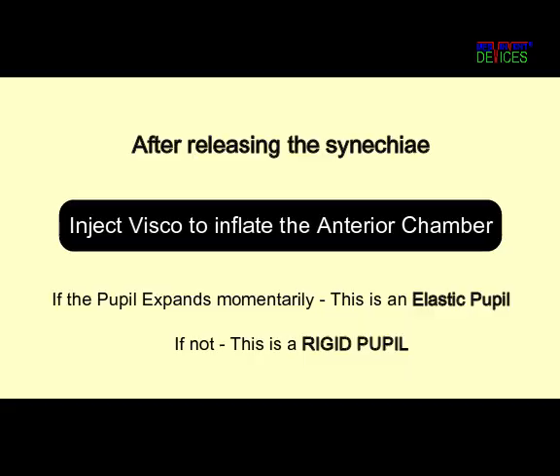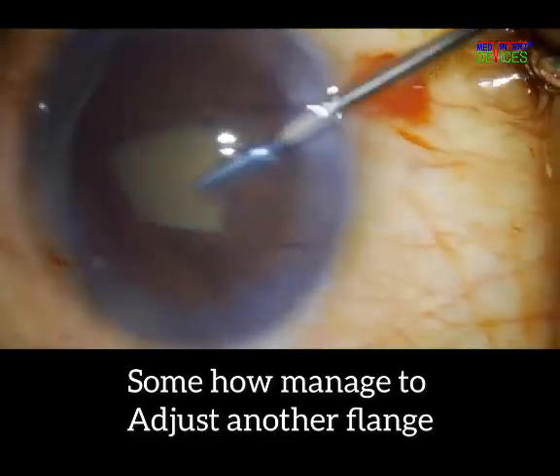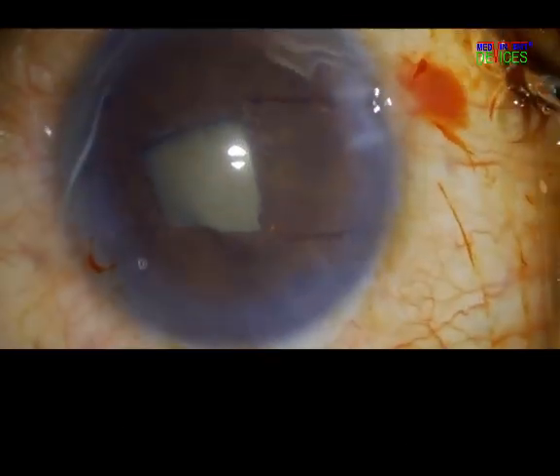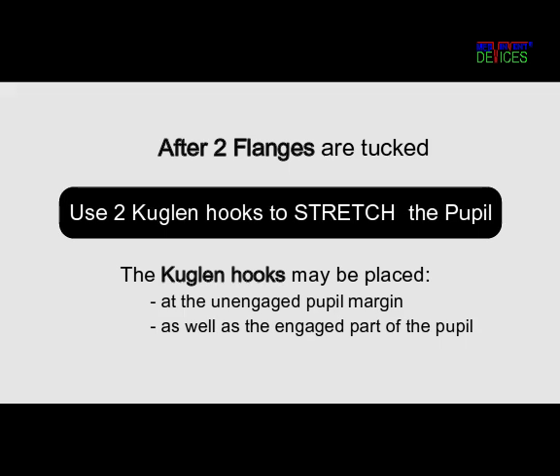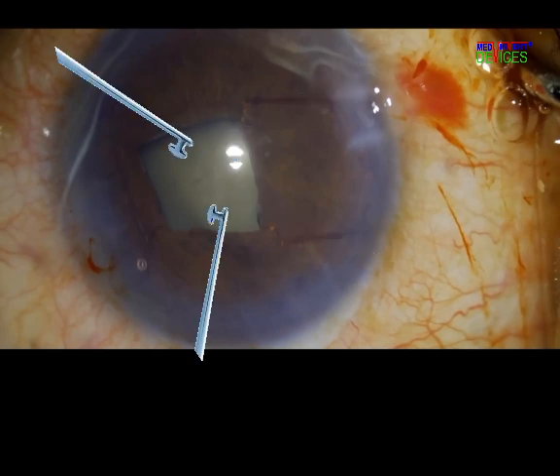Once the synechiae were released, inflating the anterior chamber with viscoelastic would again have revealed the rigid nature of the pupil. The B-Hex is very forgiving — even after the second flange is tucked, the pupil could be stretched with two Kuglen hooks. The hooks may be applied either at the free pupil margin or even at the engaged part.